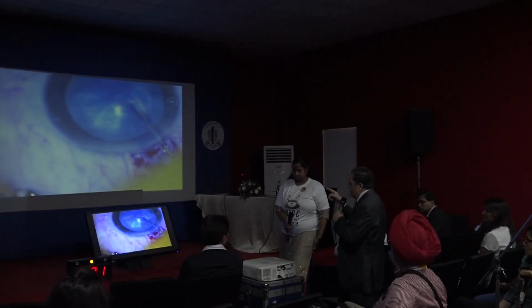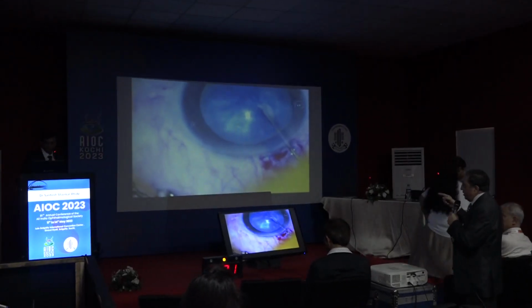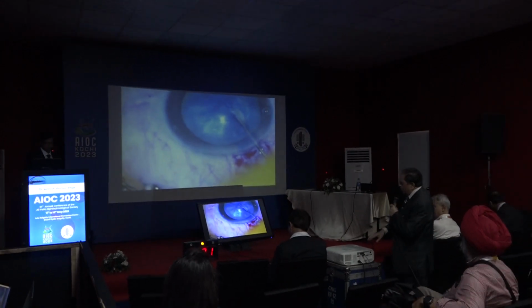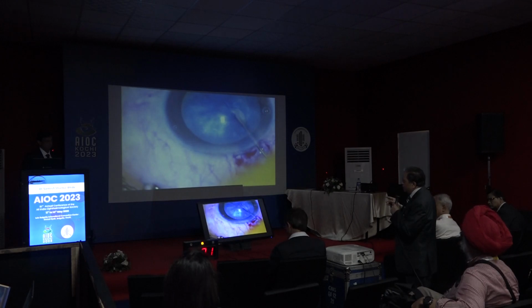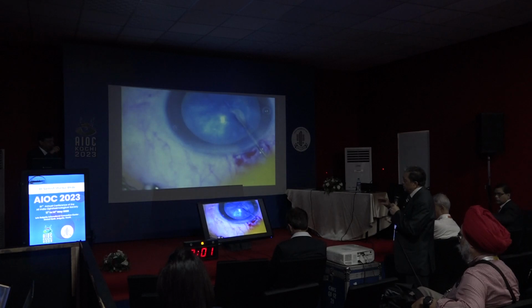Sorry, I have not seen all of your cases. But the 3rd and 4th cases which you were showing, I think one thing I would certainly like to emphasize is the use of heavy viscoelastic material. Ultimately, what you need is higher intraocular pressure than the intralenticular pressure. But sometimes if you use a high molecular weight visco, it can run to the periphery.